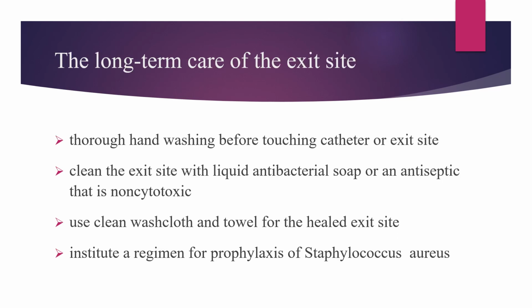The long-term care of the exit site includes, but is not limited to, thorough hand washing before touching the catheter or exit site. Clean the exit site with liquid antibacterial soap. Use clean washcloths and towels for the healed exit site. Institute a regimen for prophylaxis of Staphylococcus aureus.